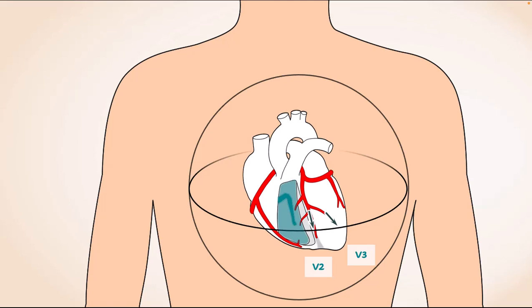The different leads of an ECG are like multiple views in an X-ray. They provide different perspectives of the same thing that help you understand the heart in 3 dimensions. And if you can conceptualize how each lead is arranged in space, you'll be able to understand why certain pathology manifests on certain leads, rather than having to memorize diagnostic criteria.